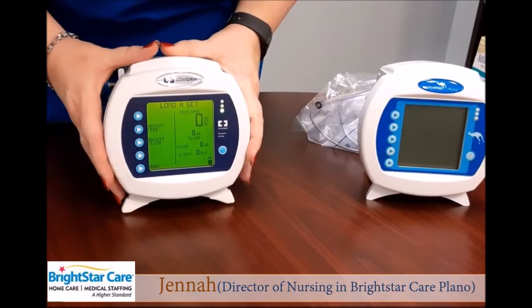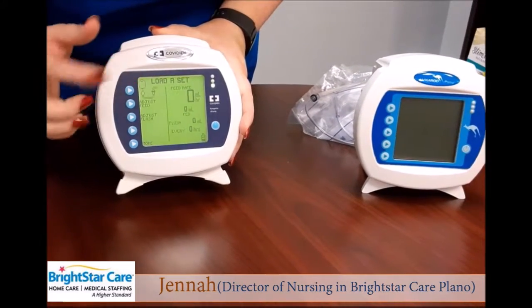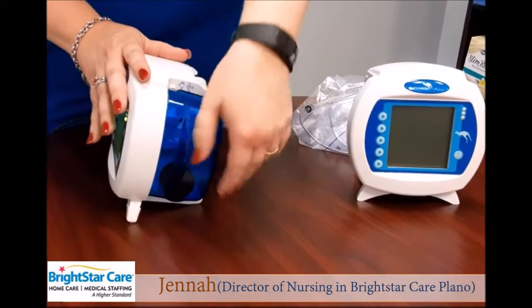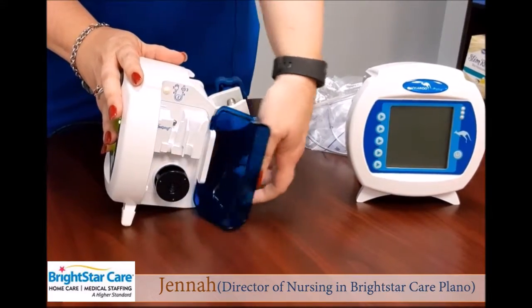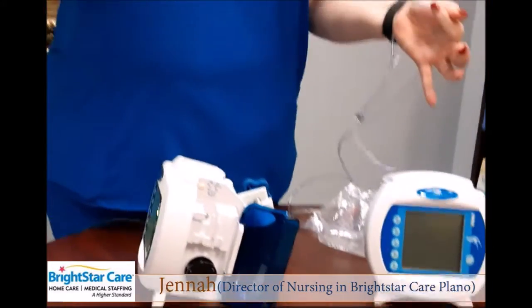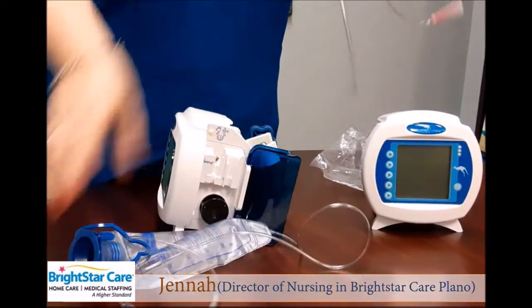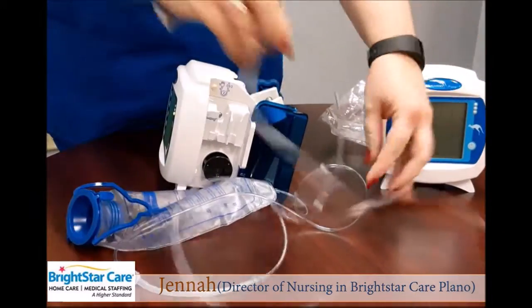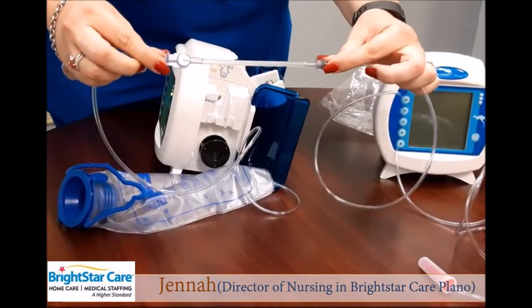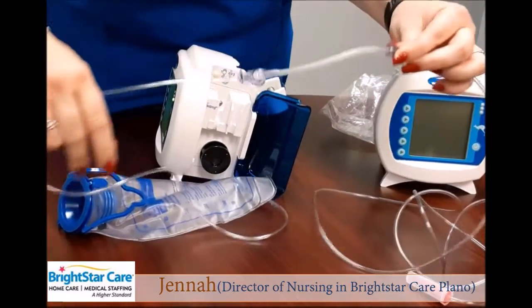You'll see the Kangaroo hop across, and if you notice, this particular pump is prompting me to load a set. To load your set, we'll rotate your pump to the blue door, which you'll squeeze and swing open. Your set will consist of a bag where you'll pour your tube feed, a line that connects to your patient, and then a loading portion of your line. You'll have two pieces on your loading portion, a larger circle with a tab, and then a smaller circle.